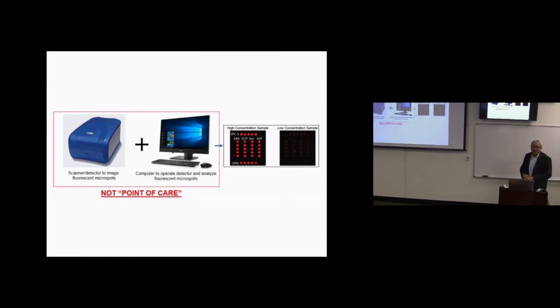So we now live in this era of next-gen sequencing, PacBio, Illumina. There was an era which the young people have forgotten, where people did Affymetrix, did Agilent arrays and Affymetrix arrays. You did DNA microarrays, and those DNA microarrays were imaged largely on this instrument called the GenePix, which is an 80-pound instrument, $150,000, with a fantastic PMT, great electronics, very sensitive.